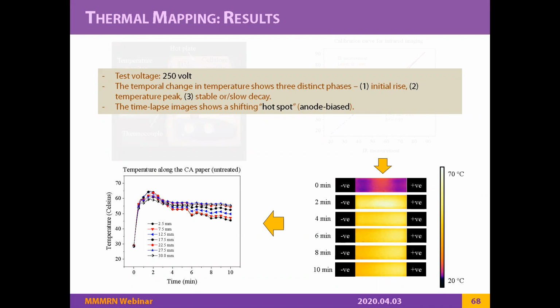It in fact did. Thanks for this response. I actually have some other questions. What program did you use for your thermal mapping? Is it a ResearchIR program? You're talking about the software or the device? Yeah. Okay, please go ahead, finish your question. So I was wondering, how did you ensure that you have an emissivity of 0.9 for the paper? Because that definitely is very sensitive in measuring temperatures using infrared cameras.